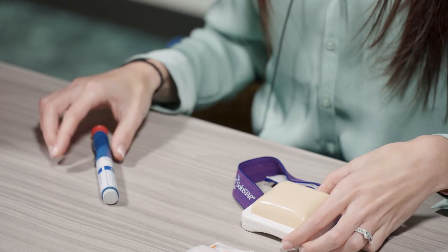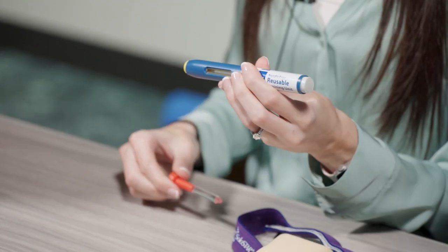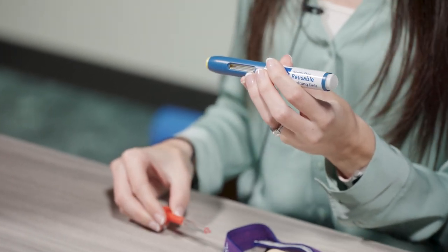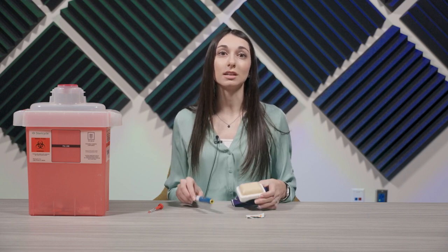Next, pull the orange cap off. It is important that you don't leave this cap off for more than five minutes because you can actually dry out the medication. It's also important that you don't put the cap back on. Create a firm surface by either stretching or pinching the skin. Hold the pen against the skin at a 90-degree angle and firmly push down until it stops moving.